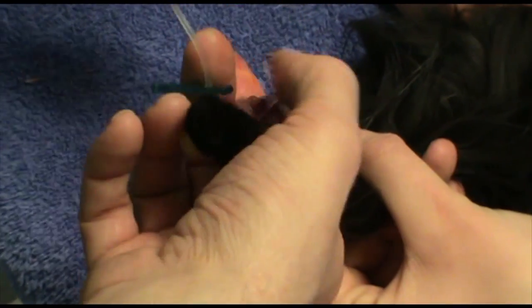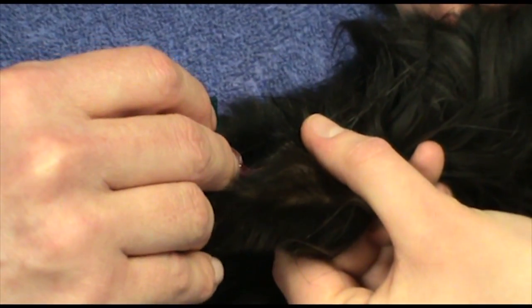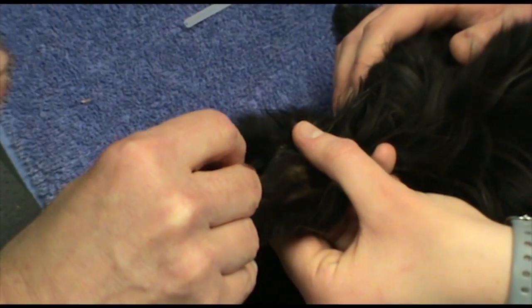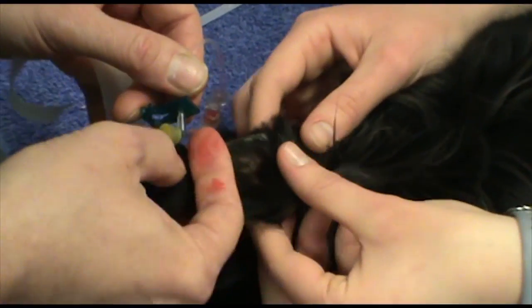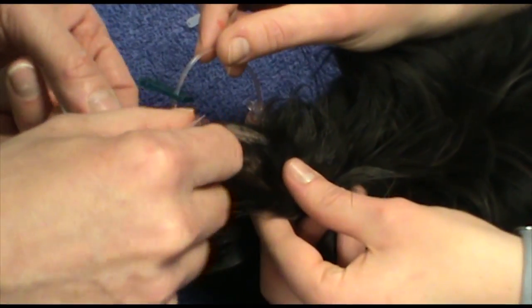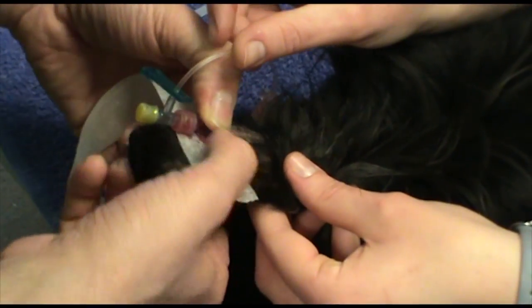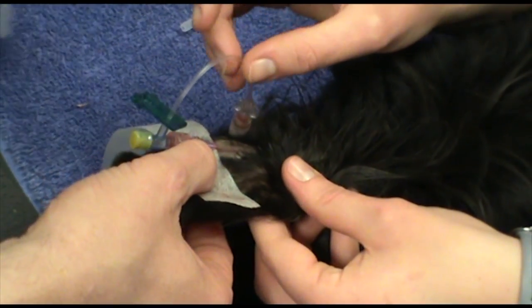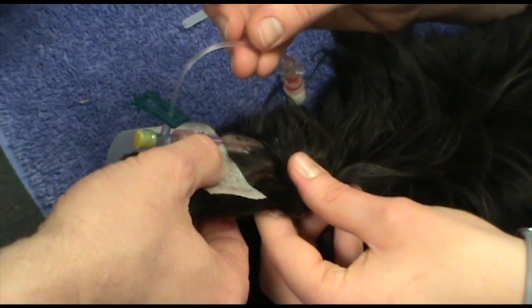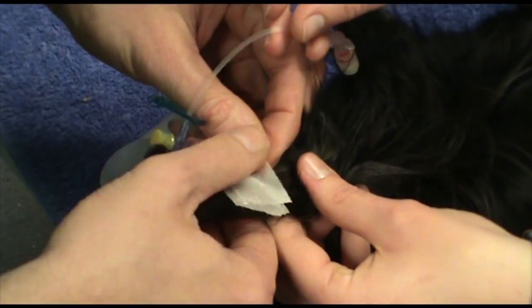There are two ways of securing the catheter. We're just taping it in as we would do for any other species or animal. They're so thin-skinned there's no need to make a nick incision through the skin — they're literally incredibly superficial. We take tape underneath the catheter between it and the skin so we've got a nice clear space without hair, and then one on top to secure it, making sure we go over the skin-catheter interface.